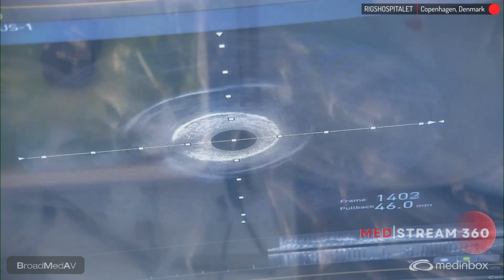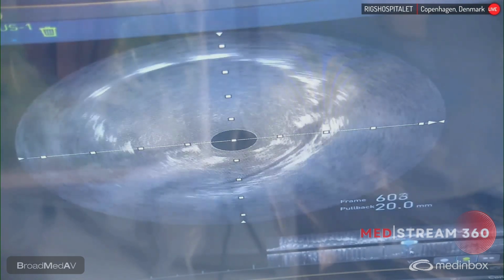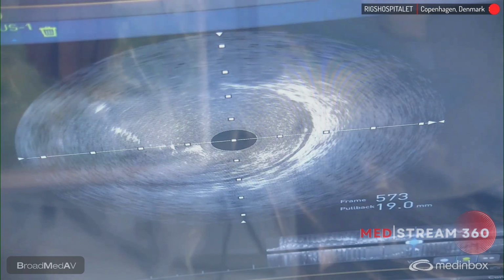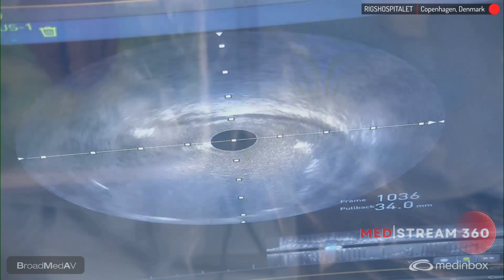And we definitely need to post-dilate the stent and flare it. You've been there with a 4.5. You could go with a 5.0 there, and then a 5.5 at the left main. Now I think the landing zone is fine. So we go with the 5.5 for POT in the left main and flare it even more at the ostium.